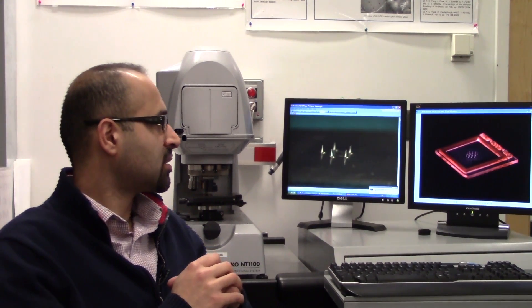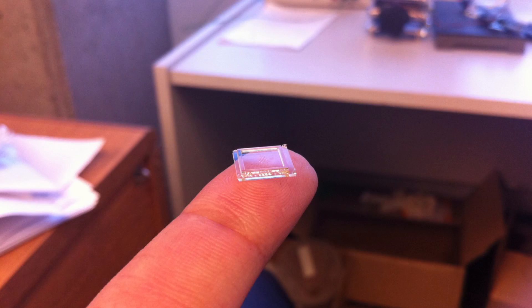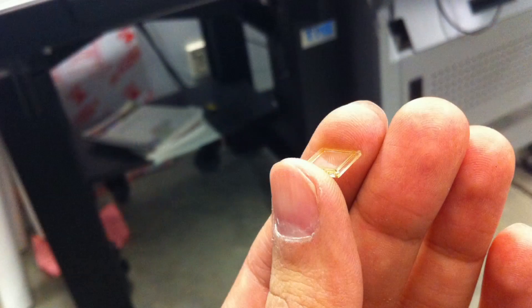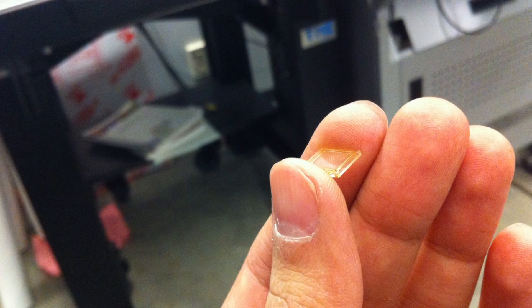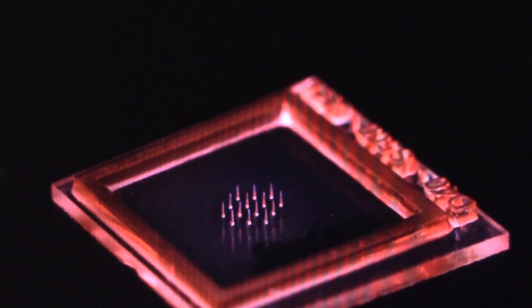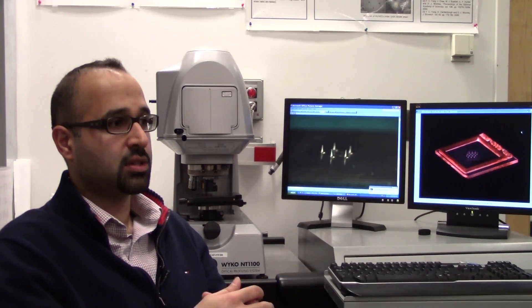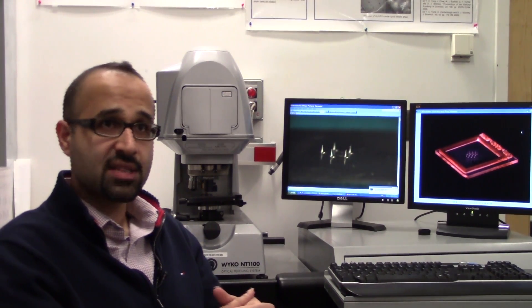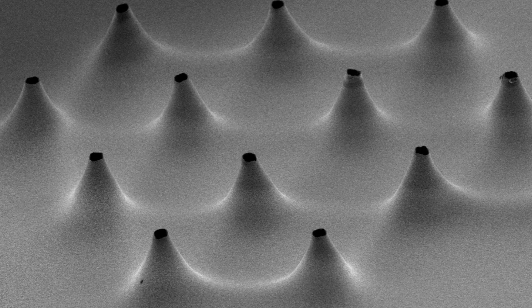We started this whole project from scratch, from concept. We wanted to come up with a procedure that is cost-effective. The way that we make these needles is we have these molds which have an array of pillars, and we deposit the polymer solution. When the solvent evaporates, layers form around these pillars. We started developing this fabrication procedure for plastic needles, and plastic is a very cheap material.